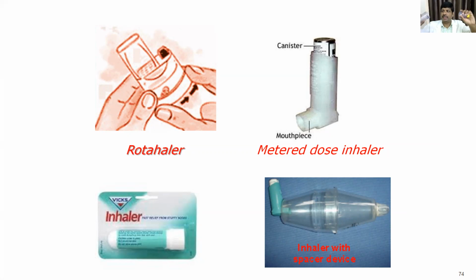These are the two parts. They can be interconnected like this, and then you have a mouthpiece here. Okay, mouthpiece here, and this has to be placed. This inhaler has to be placed here. Okay, and then this has to be put in the mouth.